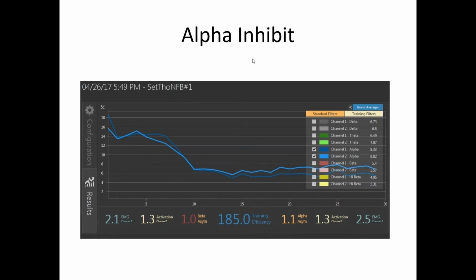But with each of these strategies, for instance, that BrainMaster and NeuroGuide take, they are very forward-thinking, very innovative, and that's a good thing. We do want people going down those paths, pushing the envelope. But the majority of us who are clinicians just want something simple, basic, and reliable that we know works, that's established, that'll get the job done.